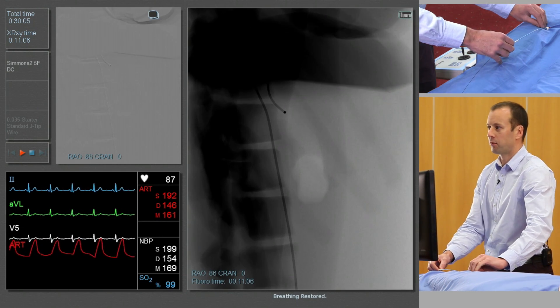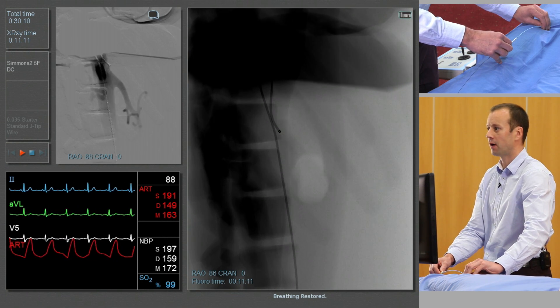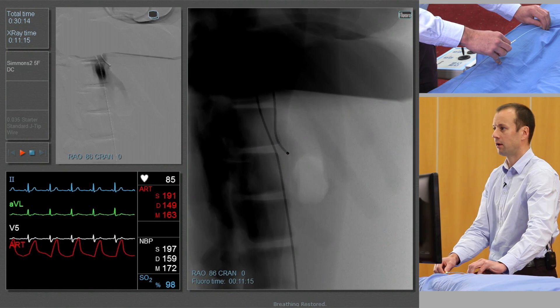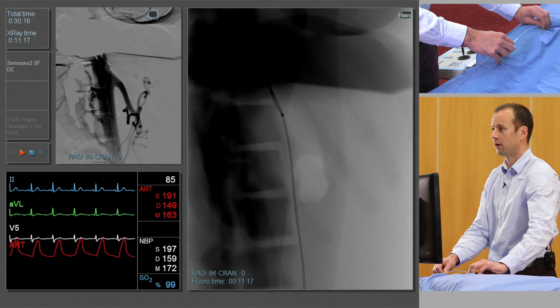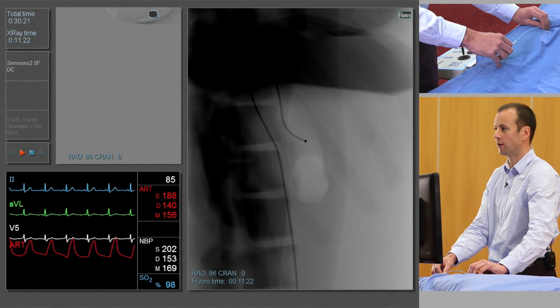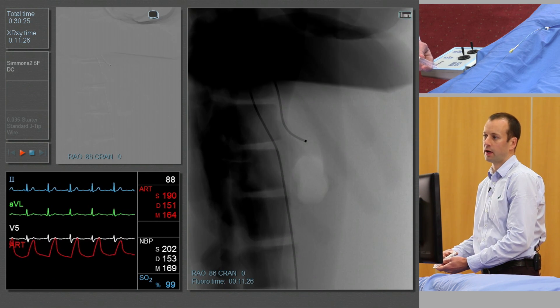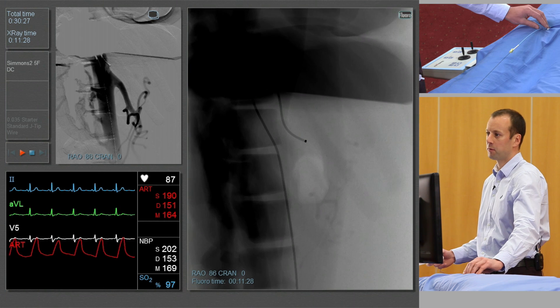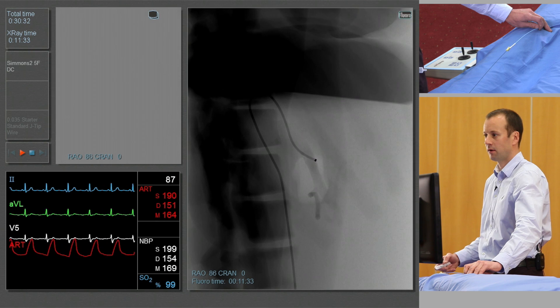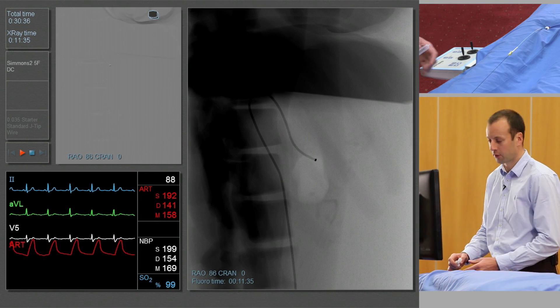So in the same manner as before, to engage the vessel, we'll point the catheter anteriorly and just withdraw it. You can see the catheter deflects into the origin of the superior mesenteric artery. Just a little injection of contrast to confirm the position. If we want to engage it further, we just pull the catheter further in. We can confirm this by doing another subtracted angiogram.